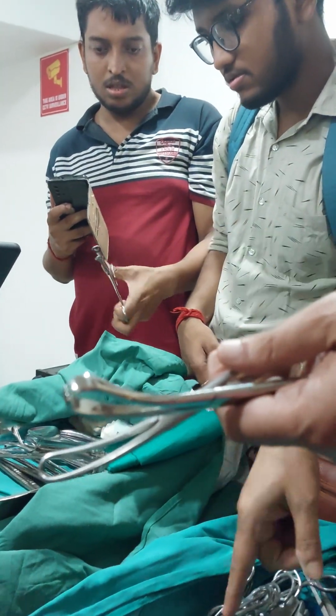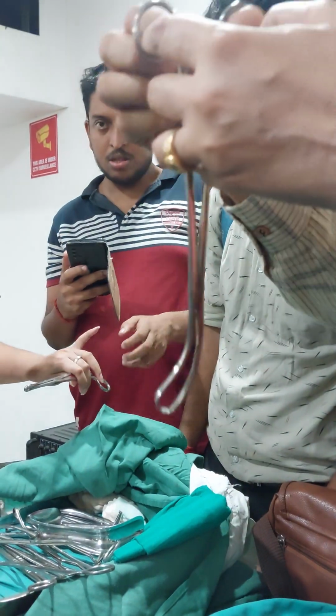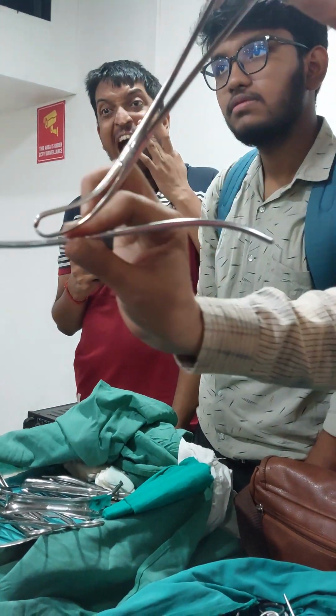Sir, holding this, then I will insert the dilator. Yes. After holding the anterior lip of the cervix with the left hand, then start with the smallest one. You dilate the cervix like this.